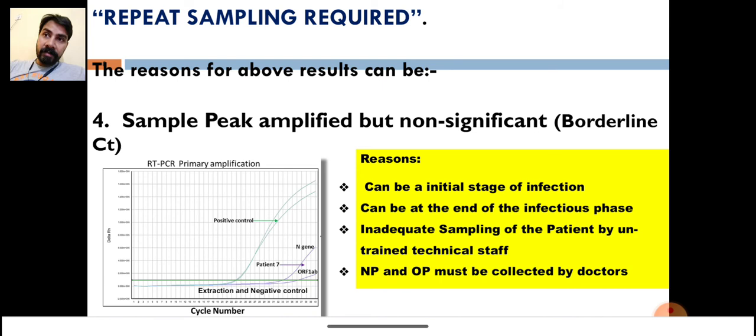On the basis of the papers, the sample will be declared as negative. But it might be possible the sample collection was not proper and we will not get the proper viral number to amplify. If the technician has collected a right sample, it can be initial stage of infection or at the end stage of infection.